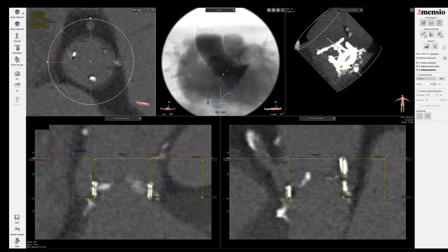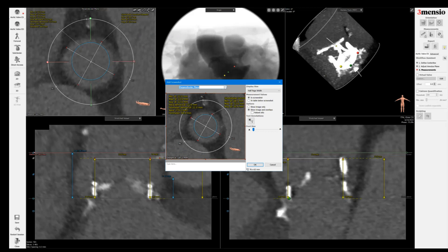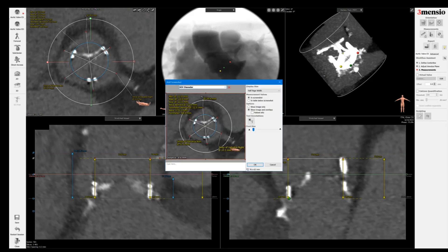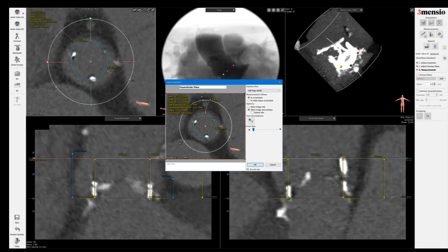You can also see this one has some artifact in terms of the delineation of the aorta. The VT-STJ is 3.8 facing the left main and 3.6 to the right. Remember there are sinuses that you can actually go down and still perfuse the coronary, but this is the most conservative estimate. I'd like to get the STJ dimension measured and do the sinus of Valsalva here with the surgical valve in place, then do the VT-STJ on both the right coronary and left coronary.